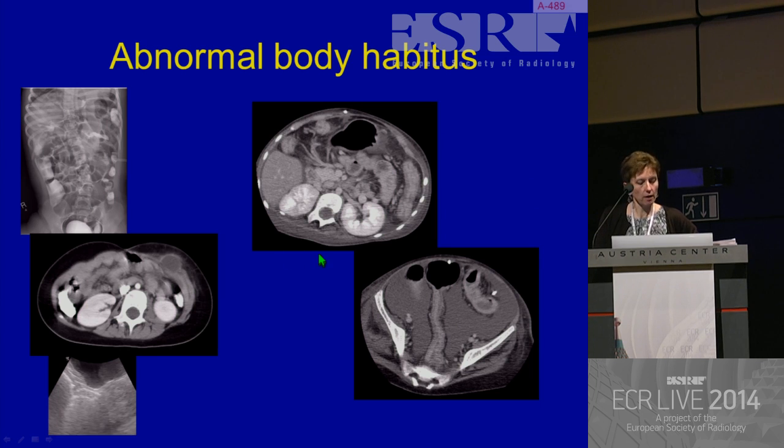Similarly, this is another complex neurodisability patient. So these are the kind of patients that we have a lot of in pediatric hospitals who presented with abdominal pain and raised inflammatory markers. On the ultrasound of the upper abdomen, we got a glimpse and we could say, yes, there's nodal disease there, we see some thick-walled bowel loops, and we also see some ascites. So they had queried whether this was an acute abdomen due to a tumour perforation. Pretty unusual, and it'd be very bad luck.